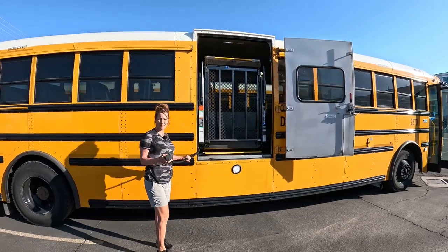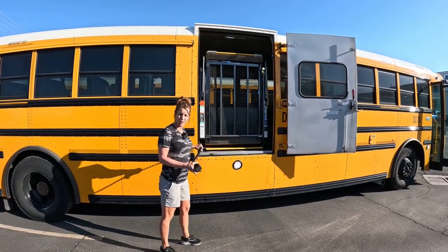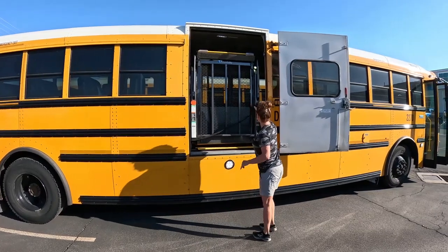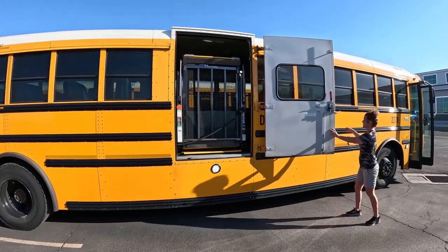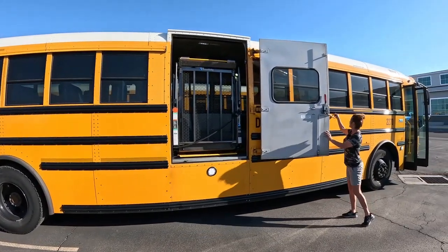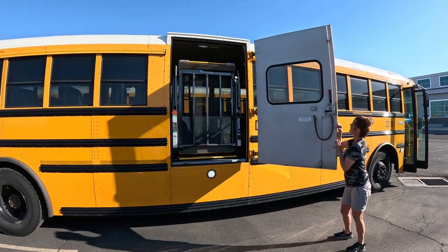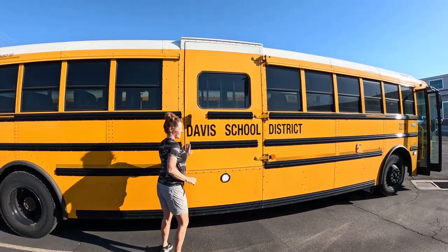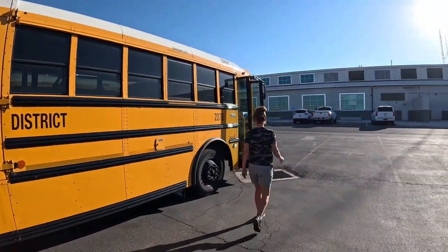Make sure once the ramp is all the way up that it's completely folded or the bus will not run. You hang it up. Do I need to turn that off? Just leave it on, and then close the door. Okay, then we're going to go load the student.